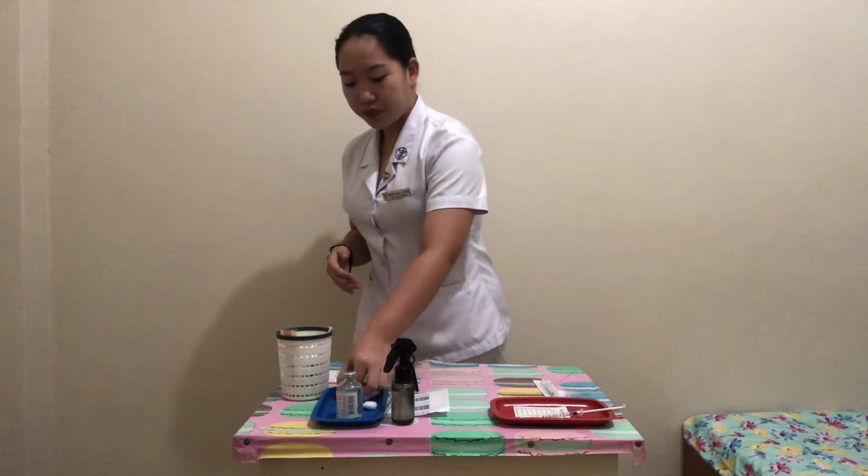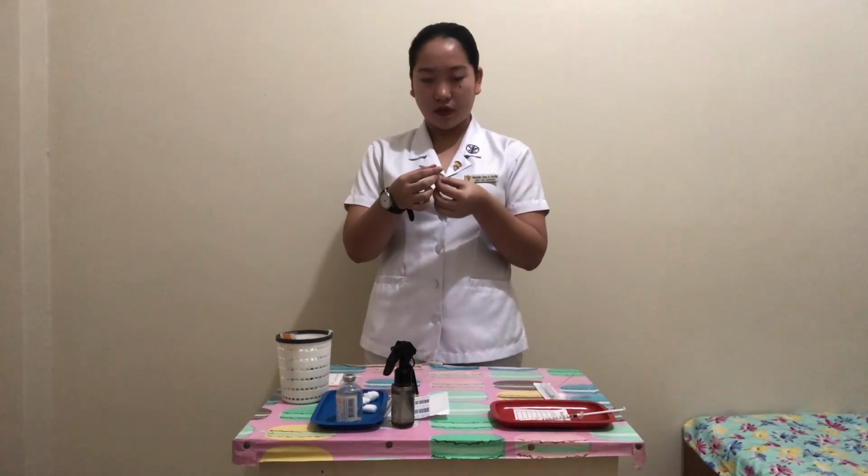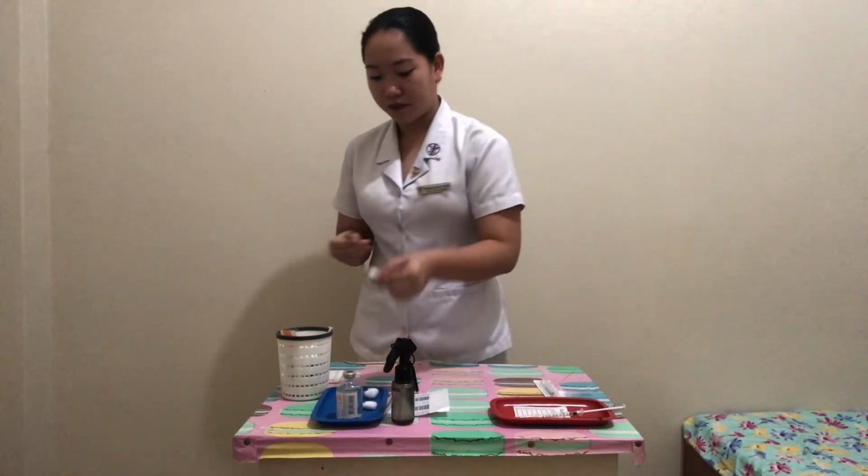So now prepare the medication ampule for the drug withdrawal. Inspect it and make sure it has no crack. Next, I'm going to lightly flick the upper stem of the ampule several times with a fingernail. And now take the alcohol prep and clean the neck of the ampule to help prevent contamination, and let it dry.